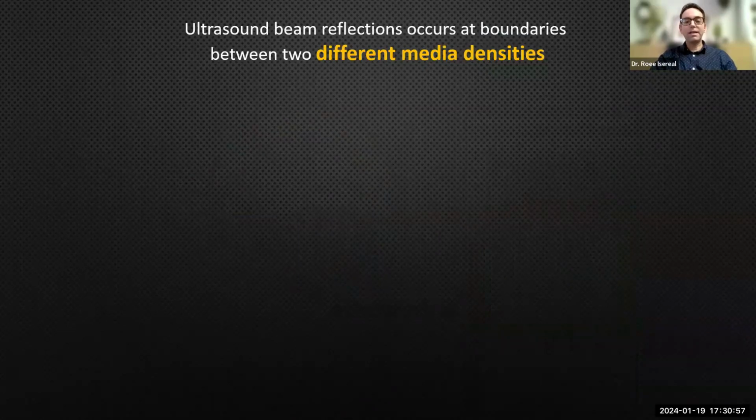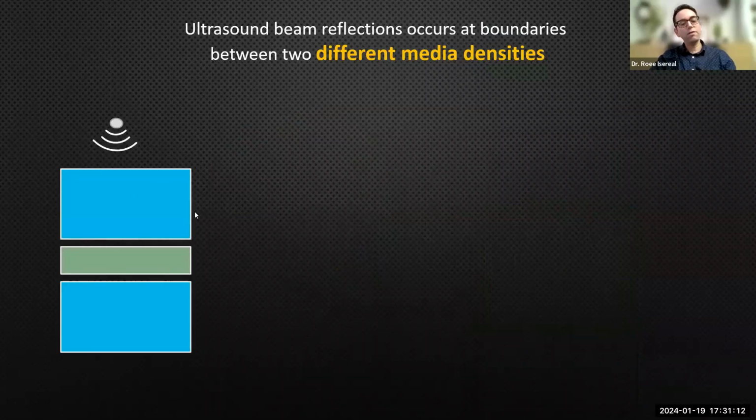Another important technical part, which I really like to emphasize, because for some reason this is a point that has been forgotten in between the lines, is that you need to remember the basic rule of physics of ultrasound. Reflection of the sound is what eventually creates the pixels. And ultrasound waves reflect backwards to the transducer whenever you have a change in the density of the tissue.